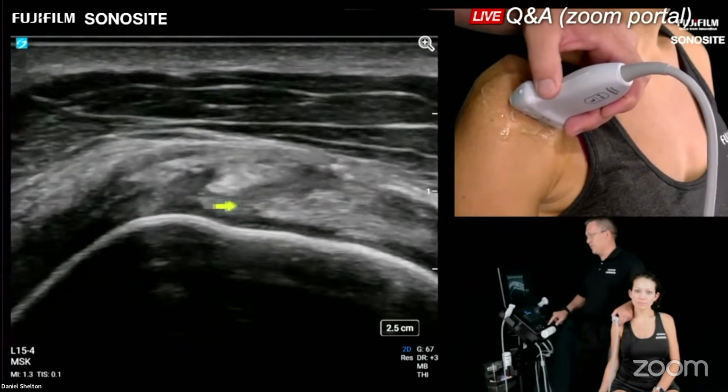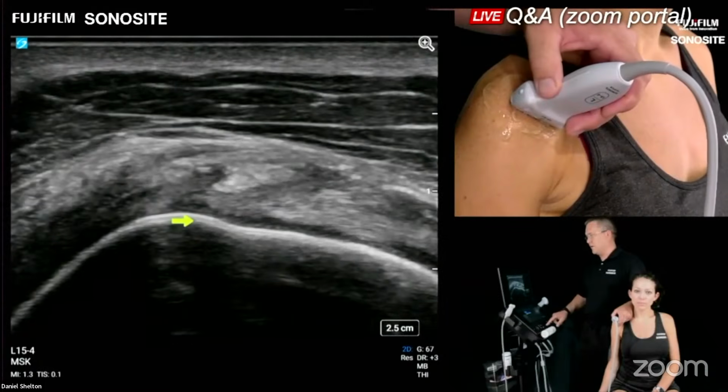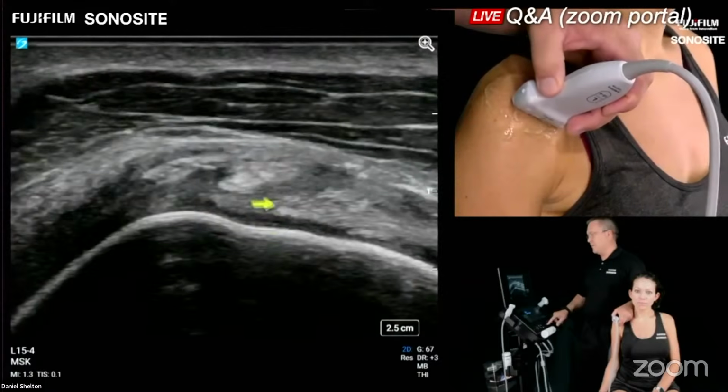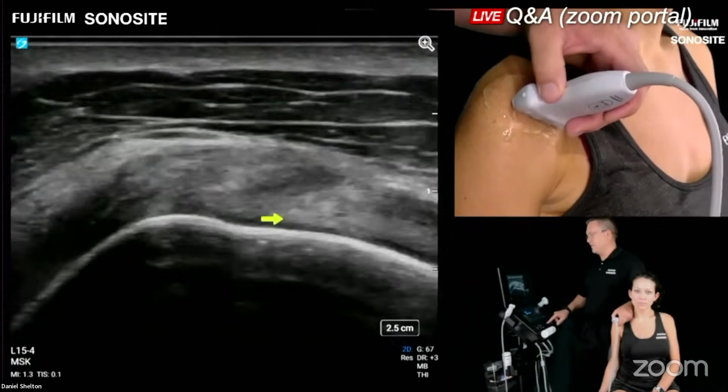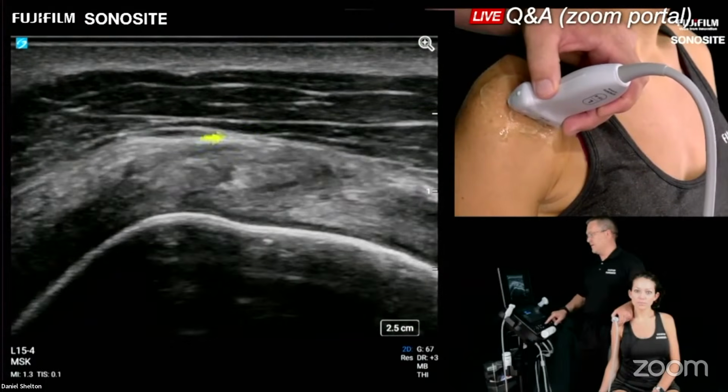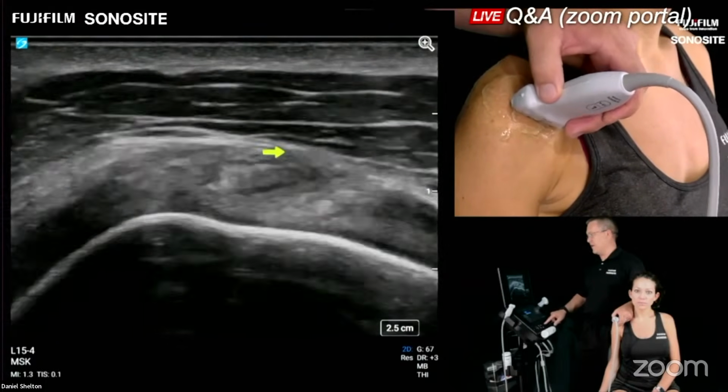That's pretty much it. So once you fall off of the acromion, look for that humeral head, then look for the biceps tendon. You're not going to see articular hyaline cartilage under here very well, and you're going to be seeing a ligamentous structure, and I think this looks like a yin-yang, this sling around the biceps.